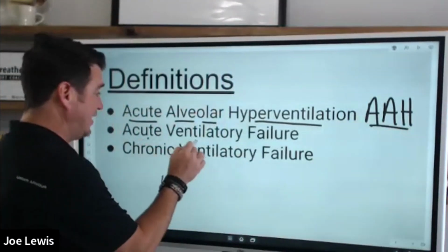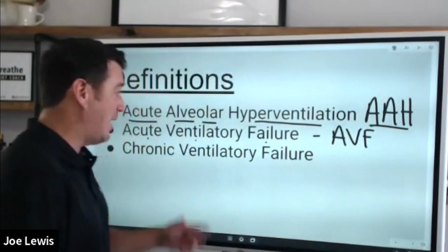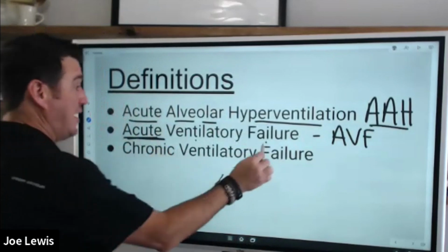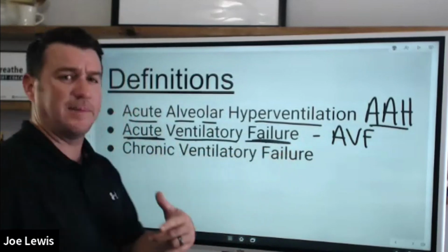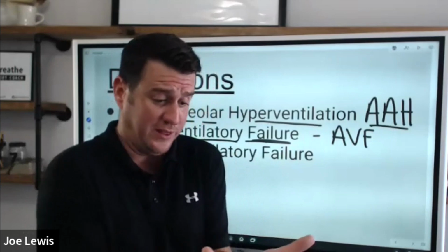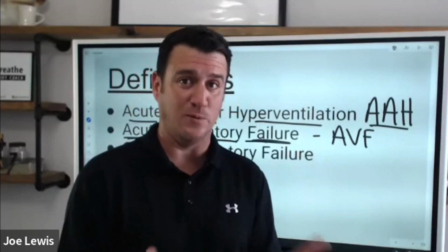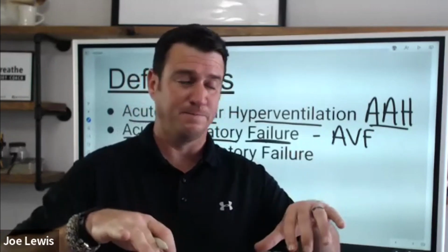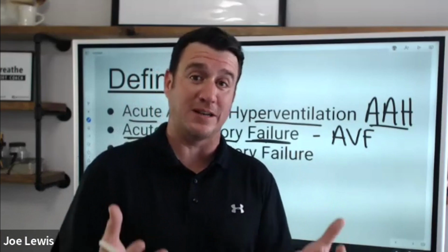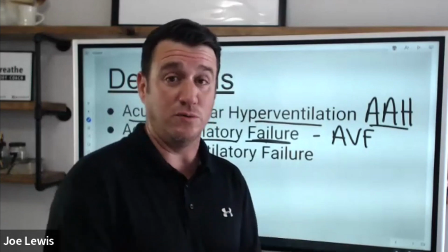Now, acute ventilatory failure. I'm going to refer to this as AVF. Acute ventilatory failure is defined by a person who is acutely failing to ventilate. Well, let's talk about what the word ventilate means here for just a second. In the realm of respiratory therapy, we know that there is a difference between a patient who is oxygenating versus ventilating. We know that ventilation and oxygenation are separate. Yes, they affect each other, but when looking at a blood gas, we will identify them as separate components. When we talk about ventilation, we're talking about the removal of CO2, the removal of carbon dioxide.